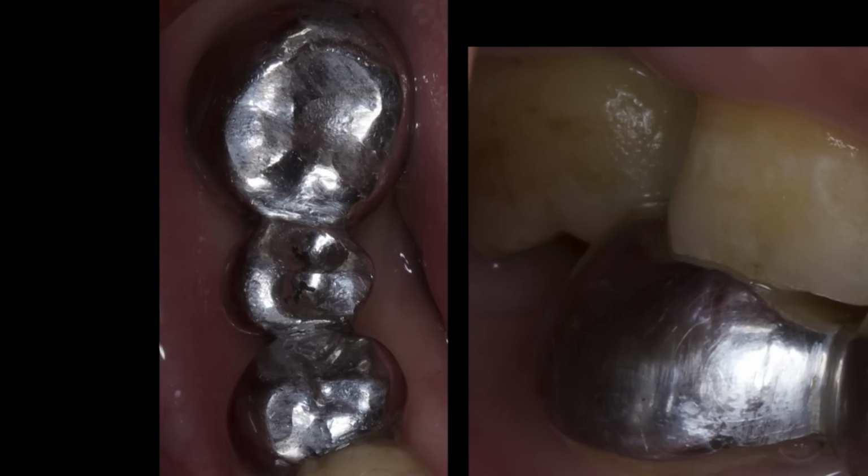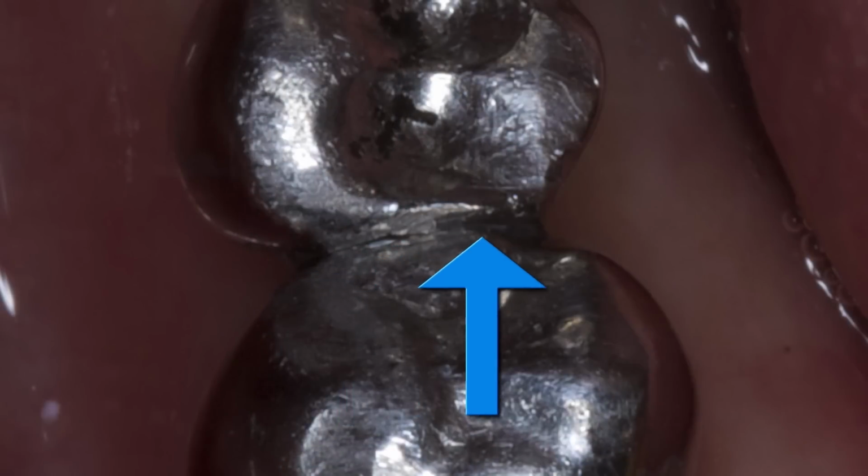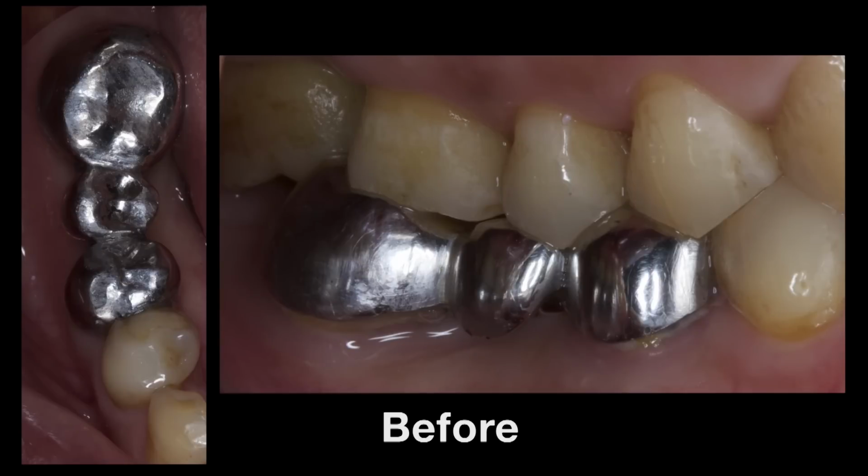Upon clinical examination, there was a fracture on the occlusal just between the interproximal embrasures distal to number 29. It was hard to see because the rest of the area was polished, so I thought this was a violation of connector space, and over time, due to occlusal forces, the connector fractured.